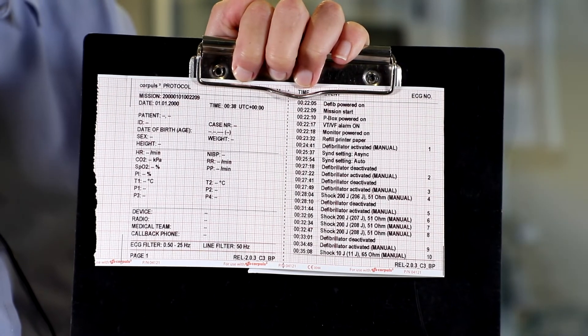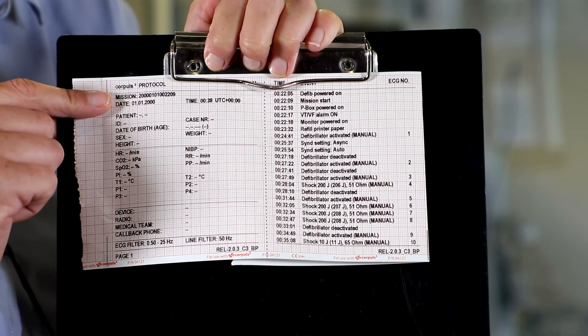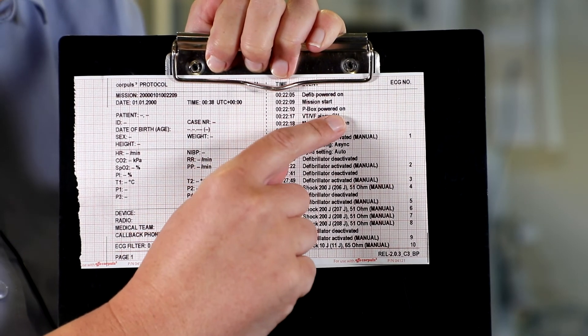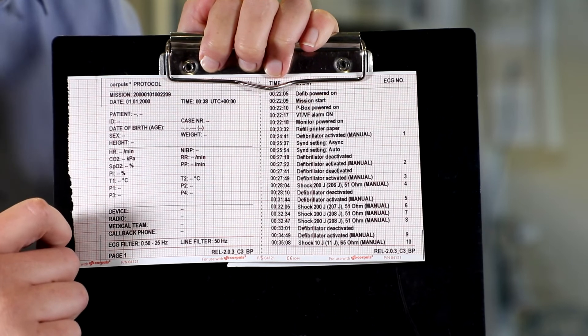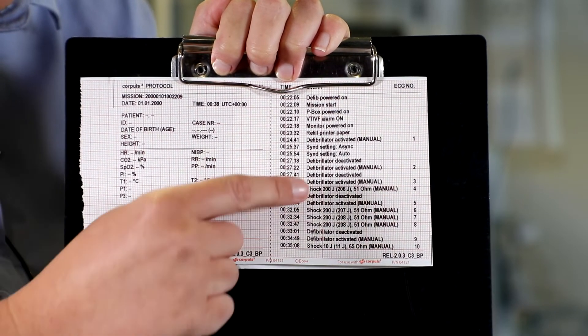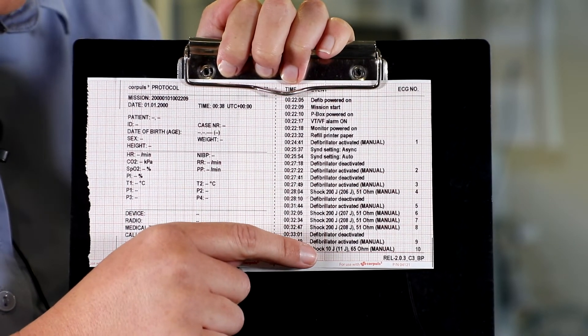Once we've got our printout, there are a few things we need to check: check that the date and time is correct according to Zulu, check that the VT and VF alarm is switched on, check the energy levels of the shocks delivered and confirm they're within plus or minus 15%. We'll check our three shocks and also check our paediatric shock.